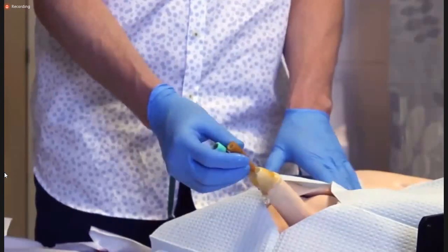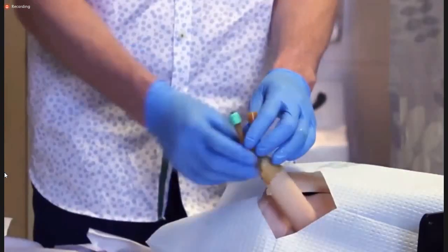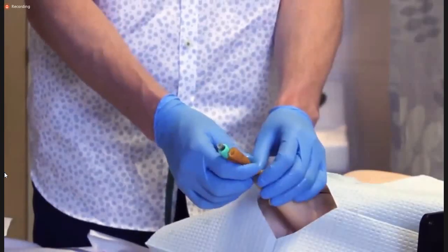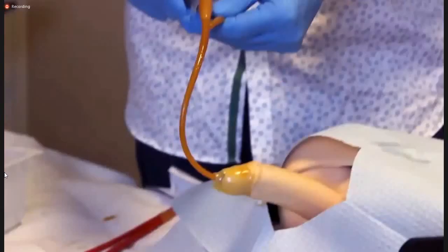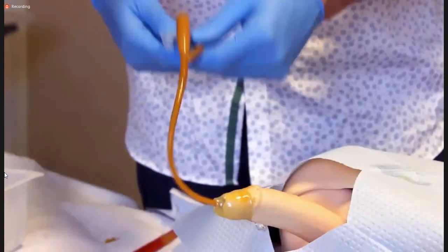Now, some people will, in fact, prior to inflating the balloon, push on the bladder, make sure there is urine. But then once you know you're in the bladder and the balloon is inflated, you pull the catheter back, you'll feel the balloon pull, and then you'll be able to drain the bladder of urine. When it's time to take your catheter out, you can simply place your syringe, deflate the balloon, and remove the catheter.